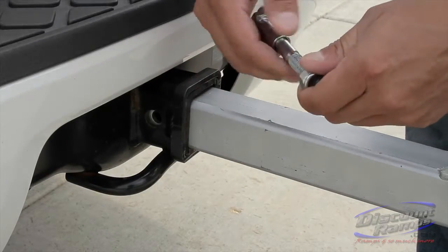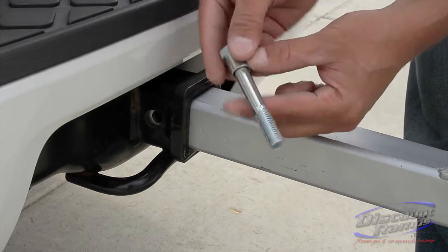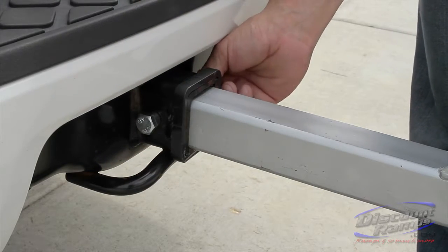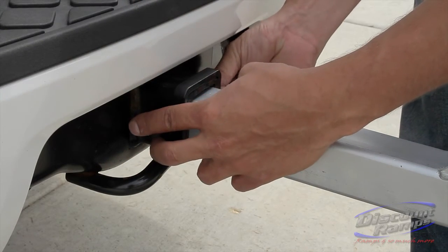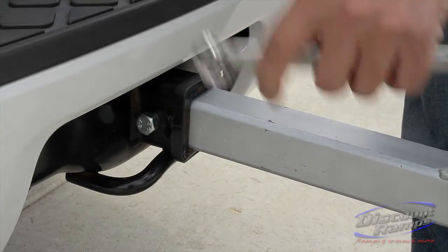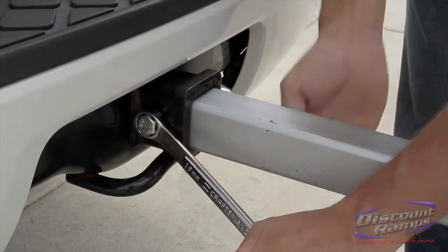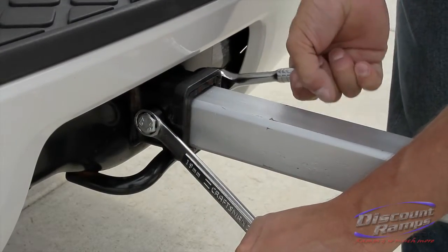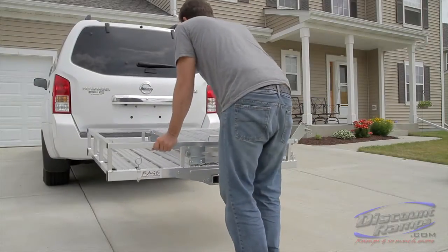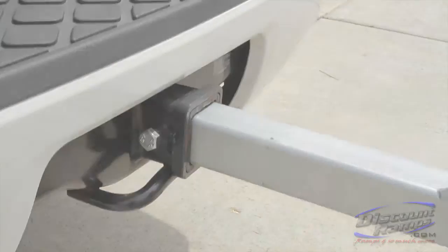To use the pinch bolt, slide the bolt and sleeve into the half inch hitch pin hole. The sleeve should rest inside the hitch pin hole and up against the carrier hitch tube. Attach nylock nut and fully tighten. Once properly tightened with either of these devices, the carrier will not wobble in the hitch.